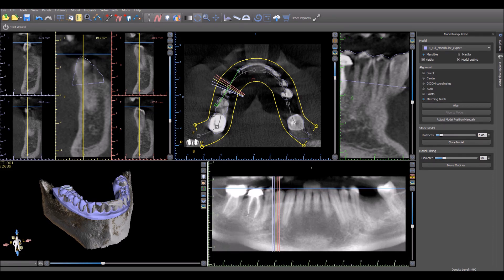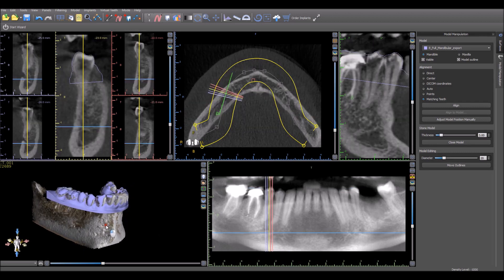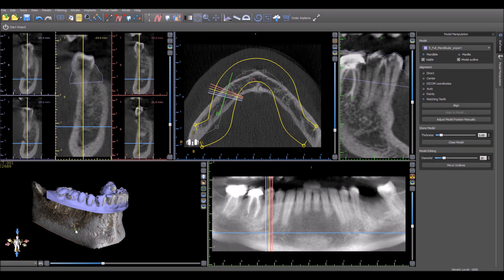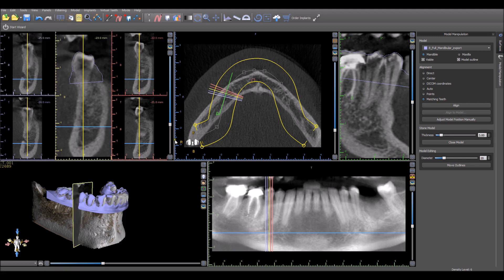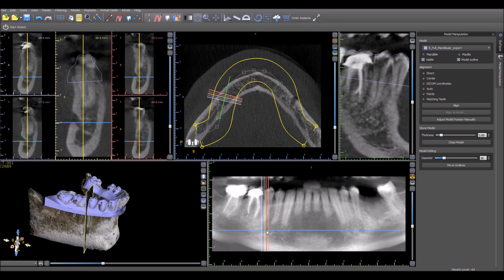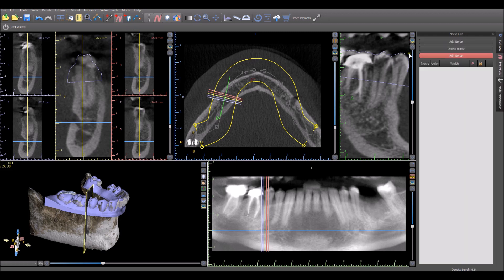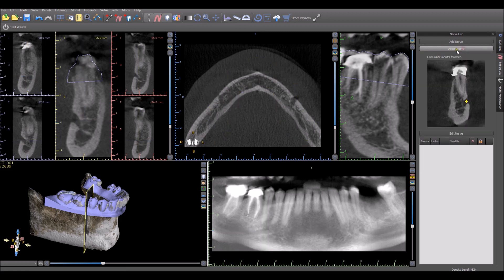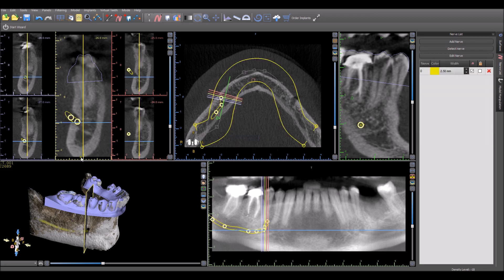Now if we want to draw the nerves, this is something we could have done earlier as well. To draw the nerves, what we want to do is identify the area where we have the mental foramen. I like turning on in the 3D view the cross-section projection so we can see where we are in relation to the mental foramen. We want to find a 2D slice that has the entrance to the mental foramen and click Add Nerve. The Add Nerve functionality has a cool feature called Detect Nerve. As in the image here, you want to click on the entrance to the mental foramen in the 2D view, and we see that the software detects the nerve itself and it shows up in all the different views.